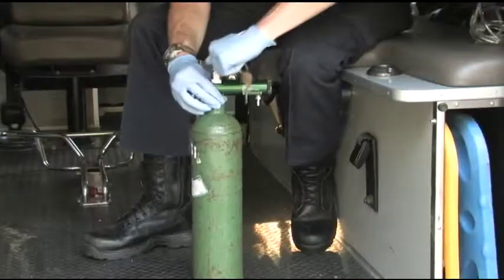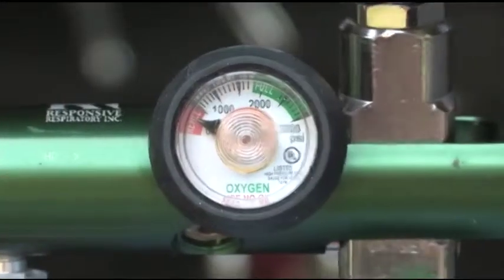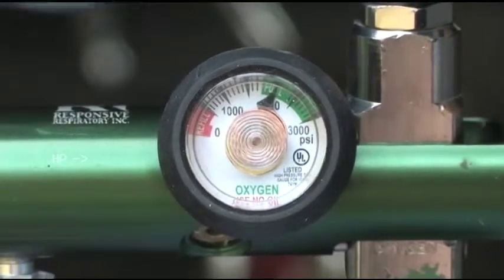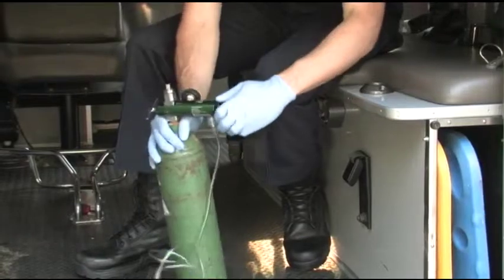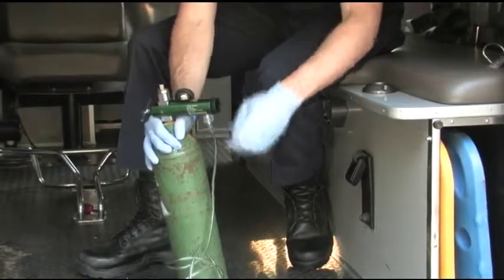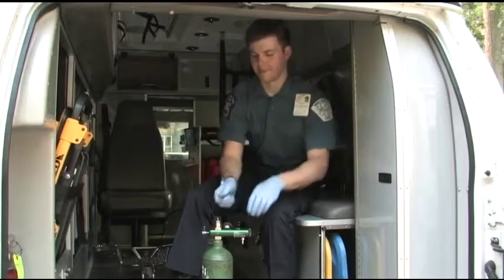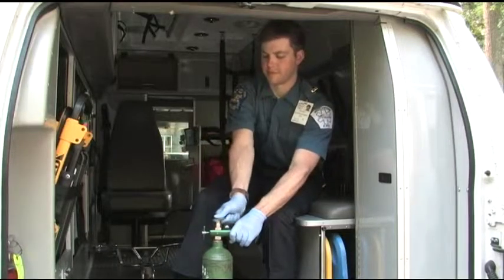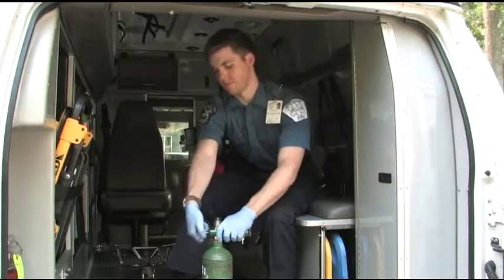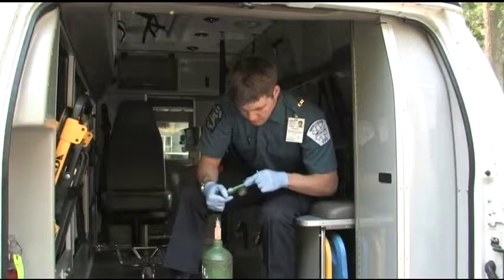Slowly open the valve counterclockwise to charge the oxygen regulator. Check the pressure gauge to see that an adequate amount of oxygen is present in the tank. Attach tubing and the oxygen delivery device of choice and adjust the flow meter to the desired liters per minute. If you open the tank valve with the regulator attached and you hear a leak, remove the oxygen regulator and check the O-ring for proper fitting. Then reassemble and try again.